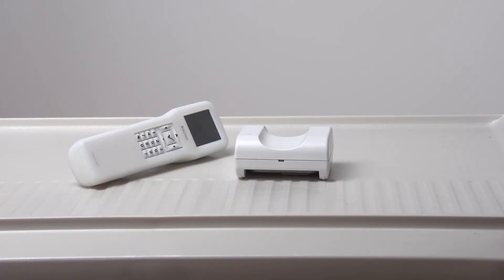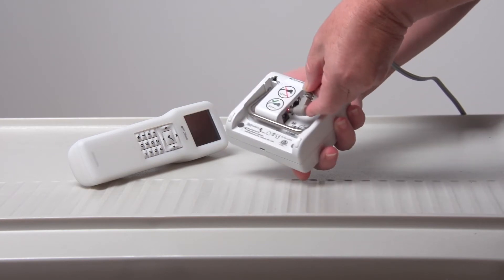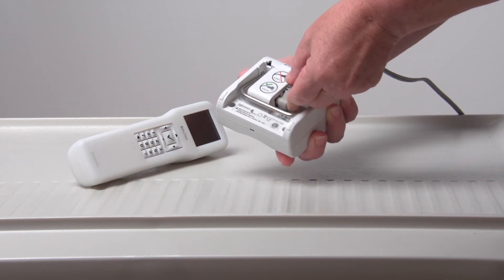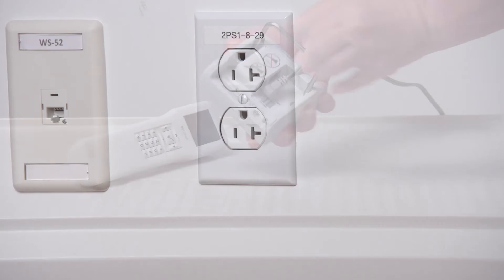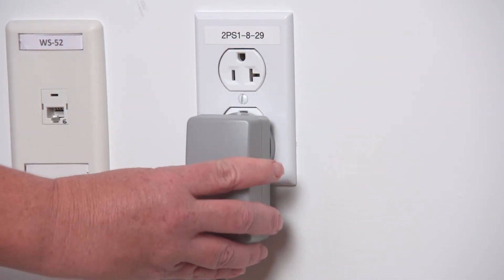Before using the Billy Check, we need to set it up. First, connect the power cord into the power inlet here on the charger base. Plug the AC cord into a wall outlet, ensuring that all connections are secure.